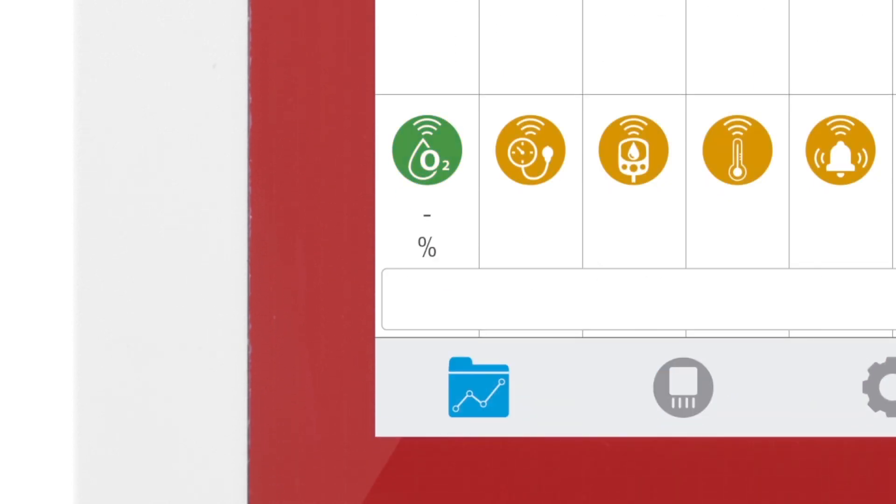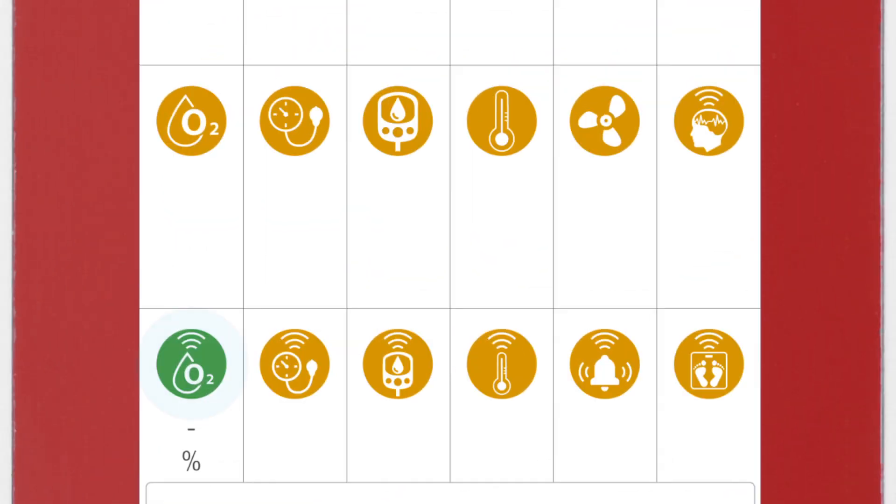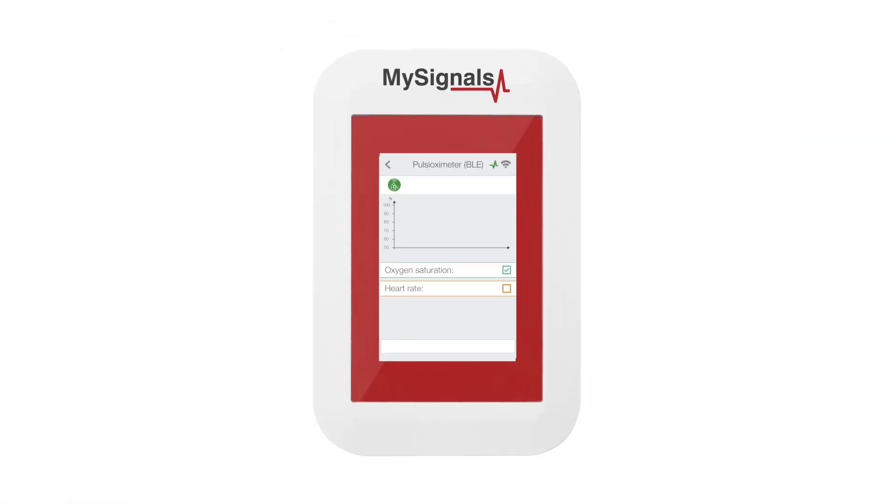Then, click on the Data button to access the data screen and start visualizing the data. Other sensors selected previously will have their icon in green. Click on the Sensor icon to start real-time data visualization.